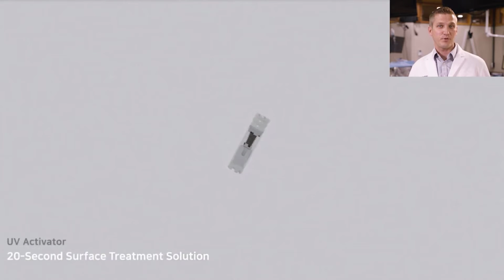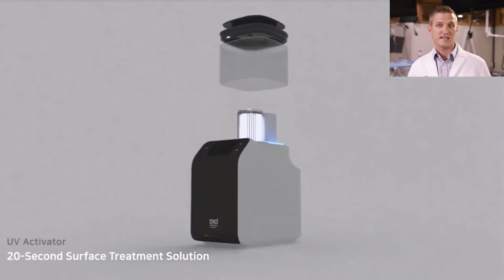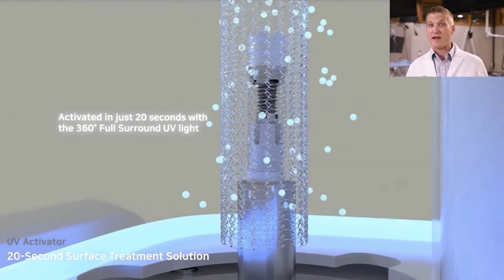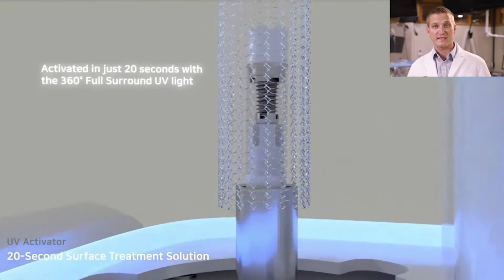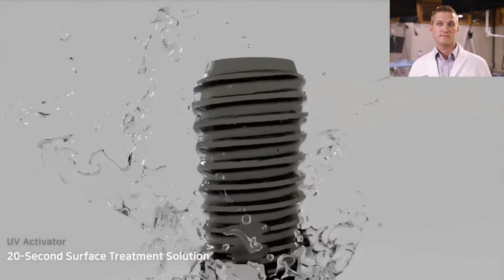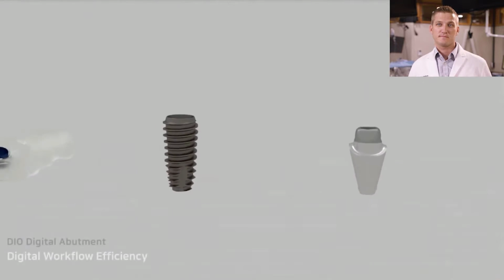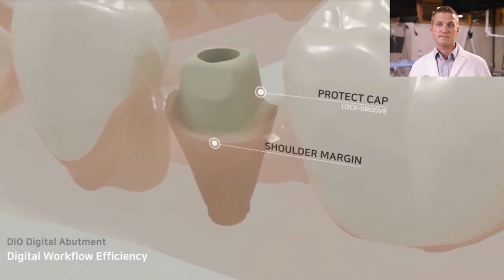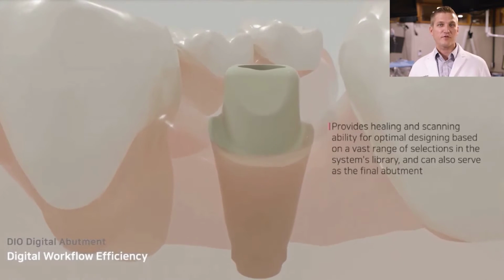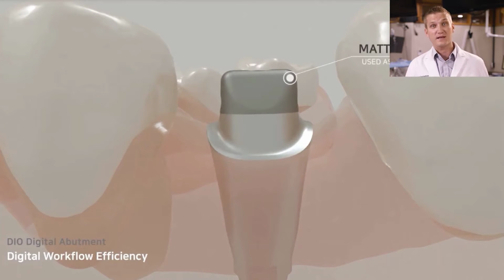And now you're going to see that implant be supercharged, so to speak, with the chair-side UV activation process. This is going to enable the implant to be even more hydrophilic, lending itself to faster healing time and a stronger implant at the end of the day. Here's the anatomical abutment you're seeing, custom fit for each area based on analysis of hundreds and hundreds of formerly made custom abutments.